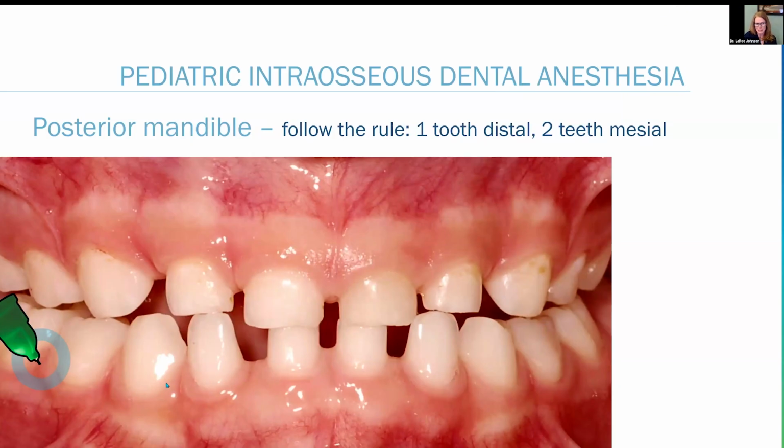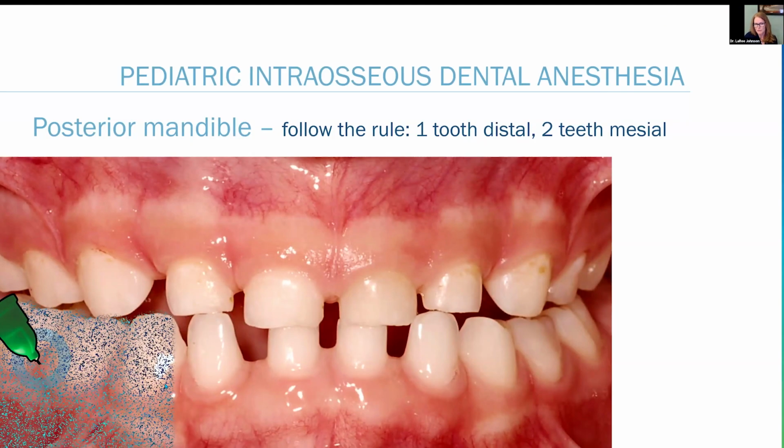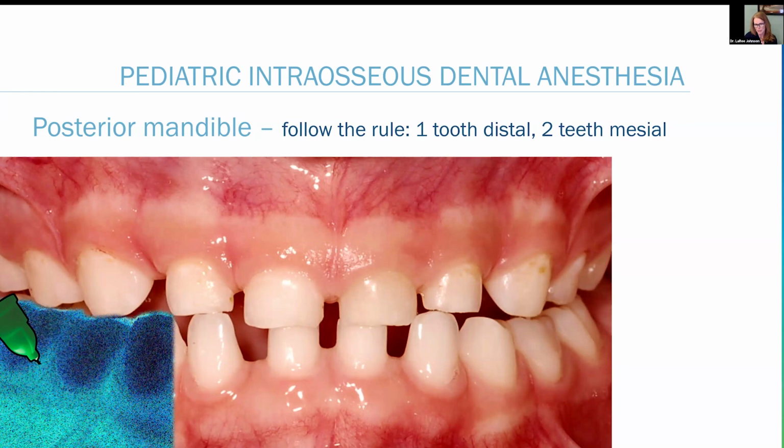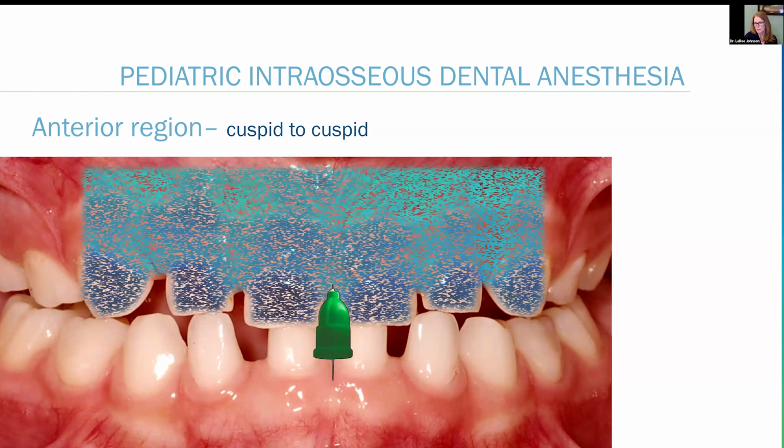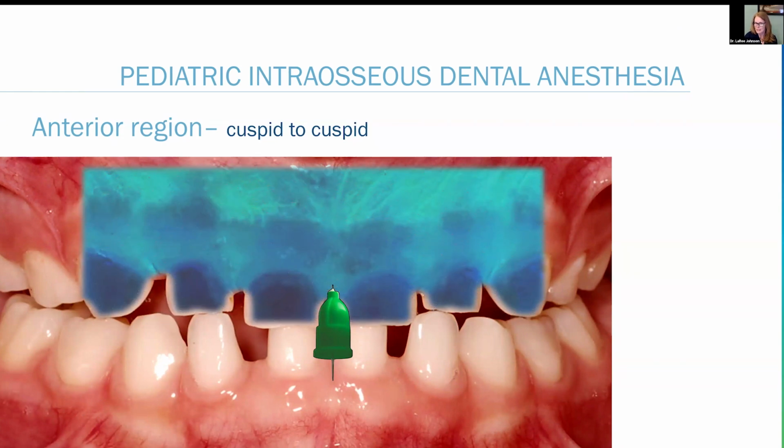But back to the little babies. When we give an injection here, it's very predictable that we're going to anesthetize those 3 teeth. We give an injection here, you would expect you would get the max anterior. Now, to get 6 teeth, 3 each direction, I'm delivering, in this scenario, to a child that's going to weigh at least 40 pounds, so I can deliver an entire carpule of 4% articaine, and I have switched exclusively to 1 to 200,000 epinephrine to increase my diffusion, because I really am not worried about systemic effects of local anesthesia now that I exclusively use intraosseous. So something to think about.